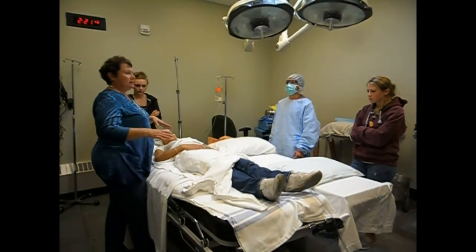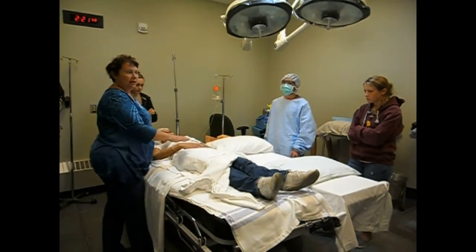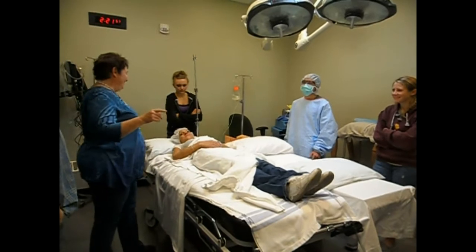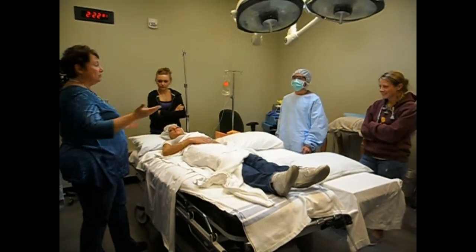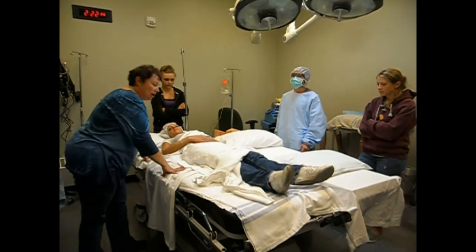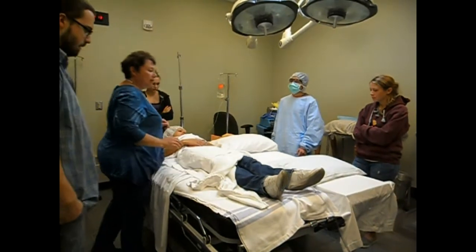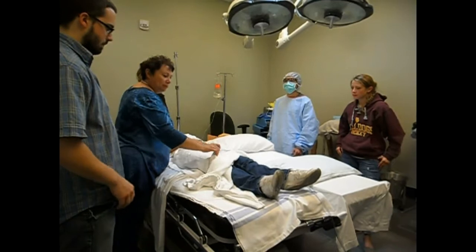Now with her, because we have a student here, obviously if we had a patient, she wouldn't have jewelry on, because you can see how that could be a problem and could get caught. And nice job. And we don't want to have any jewelry on either, because we don't want to scratch the patient. And so the first thing that we're going to do, our bed is locked, our Foley catheter has been taken care of, our IV looks pretty good. We've got both pillows ready to go there, and we might have to readjust them. And so what we would do then is we would need to remove this blanket.